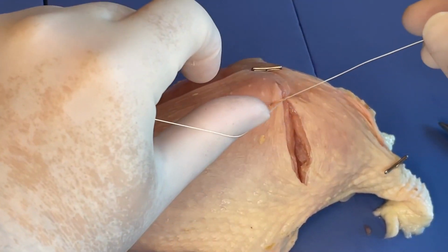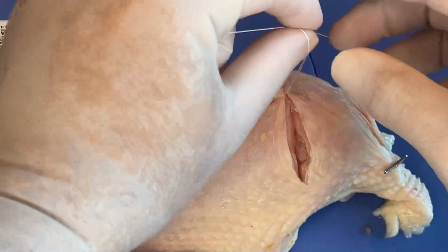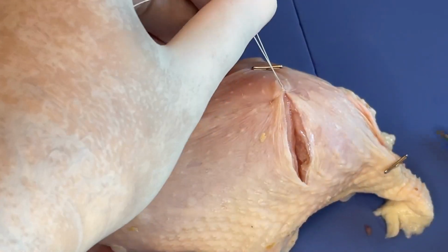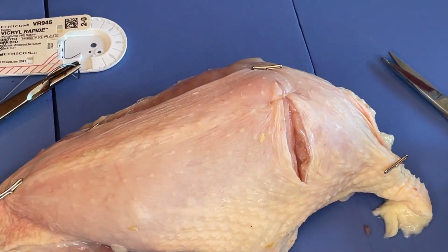So this is Vicryl. We want to do 4 throws, 2 complete square knots. So back over thumb, and then over finger, and there we go. So that's our interrupted. We want to cut that usually about 1 centimeter, give or take.